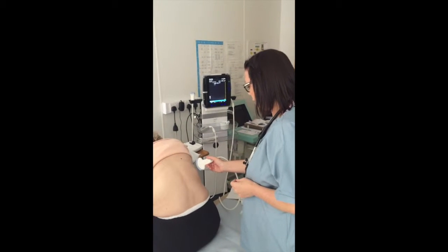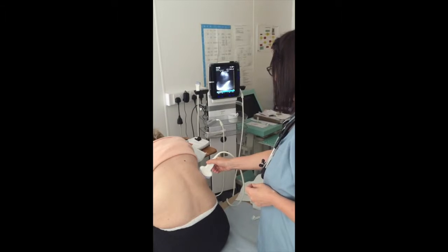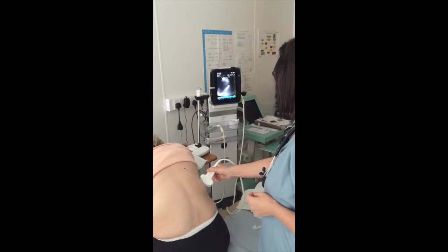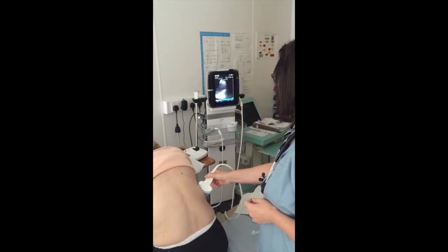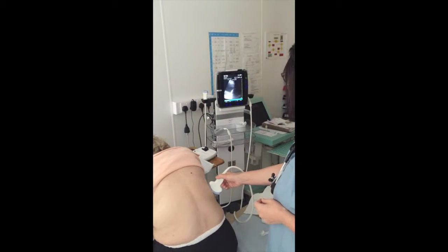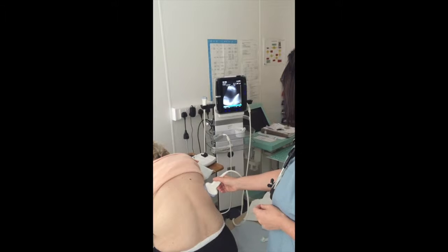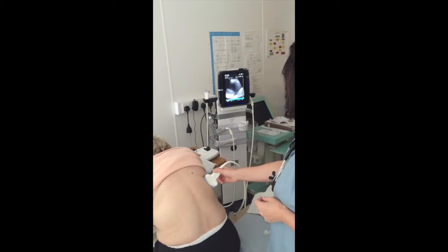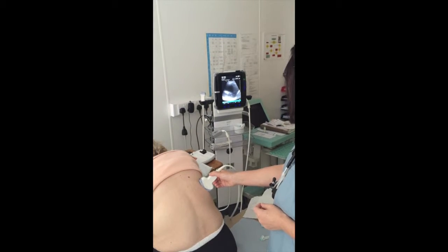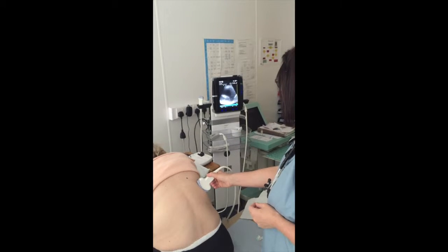So just putting the scanner on her here now. This is a curvy linear probe. The first thing we're going to do is try and identify some underlying pathology. Just down between 3 and 6 o'clock there, you can see a line which represents the diaphragm. It's echo bright because there's pathology above it. You can see above that there's a large black collection of fluid there. At the top of the screen you can see her subcutaneous tissue, and it's going to be about 2 to 3 centimetres to get into that large collection.